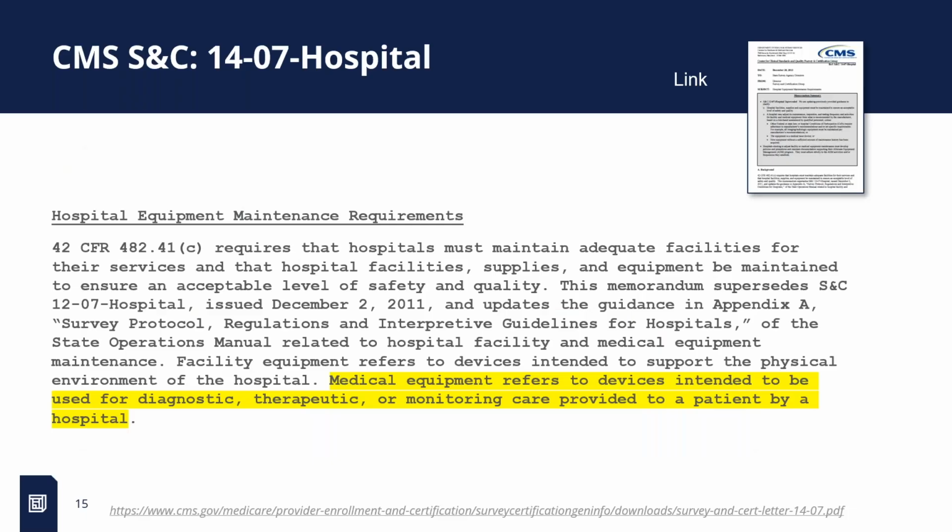So there is a document here about the maintenance requirements. This is actually from the CMS. It's from cms.gov. So if you see the logo up there, that's actually a link as well where you could download that on how to do some of those things. So again, we're ultimately all adhering, regardless of who we're using for our accreditation. It's ultimately going up to CMS, the Center for Medicare and Medicaid. I don't know why there's only one M in that one. Maybe not to conflict with CMMS. That might be the reason there.